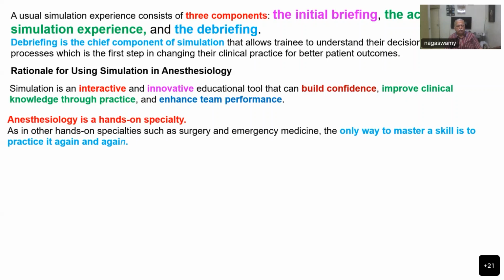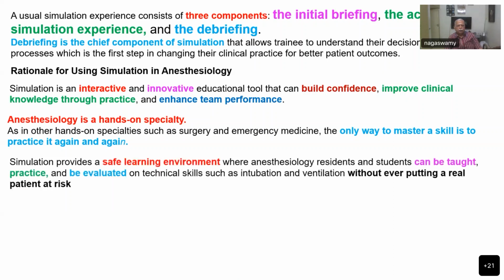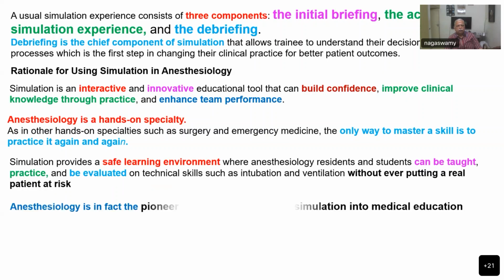You can do any number of attempts in getting a central line or performing a block or putting a tube, airway management. Everything can be repeatedly done without any risk to the patient. So it provides a safe learning environment where anesthesiology residents and students can be taught, practice, and be evaluated. We can see how fast they can learn, how quickly they are doing the skill that they have learned, and evaluate it without putting a real patient at risk. That is the biggest advantage.